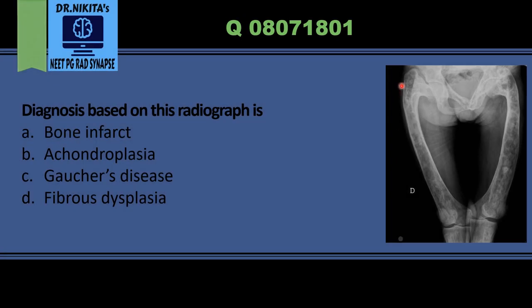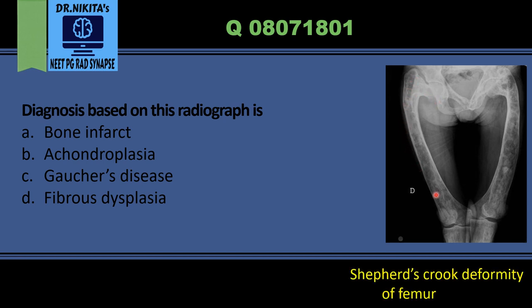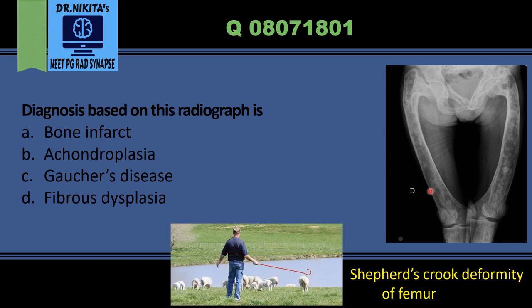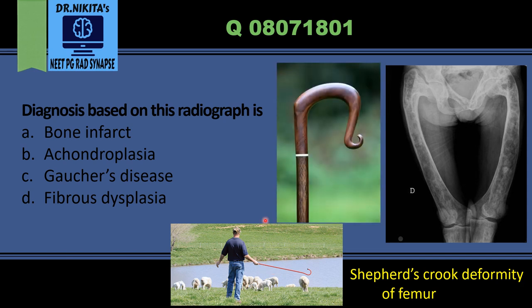Here we have a radiograph where we see this deformity of the proximal femur which is called Shepherd's Crook deformity. This is a Shepherd's Crook — the stick which is taken by the shepherd. The shape of the proximal femur here is like this Shepherd's Crook; that is, there is a coxa vara deformity.